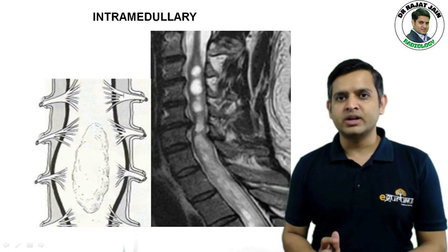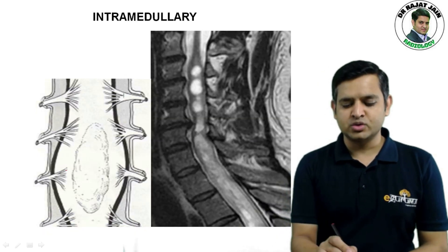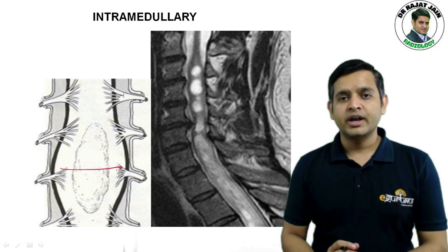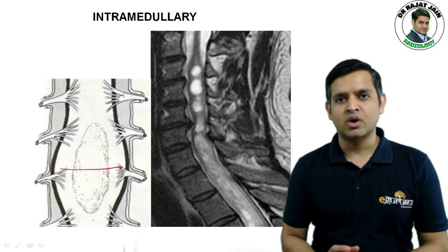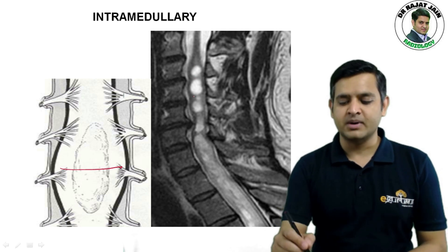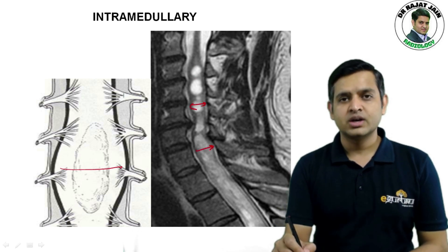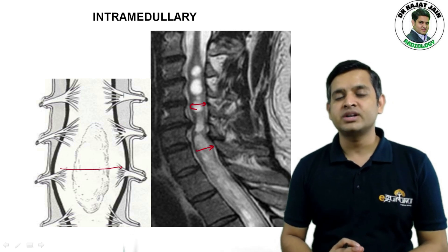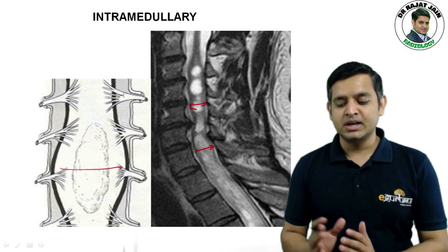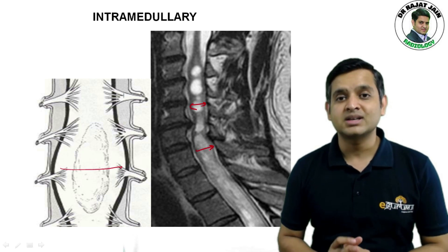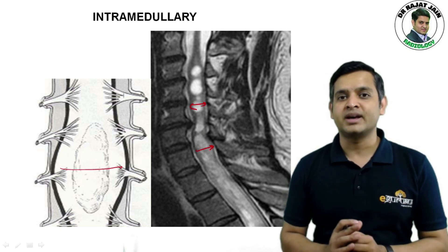If you see an intramedullary mass, it will cause expansion of the spinal cord. As you can see on this T2 weighted MRI, there is an expansion of the cord, which is an important sign of an intramedullary mass. Please note that the subarachnoid space is also attenuated in this case.